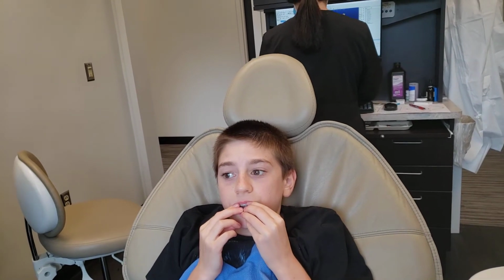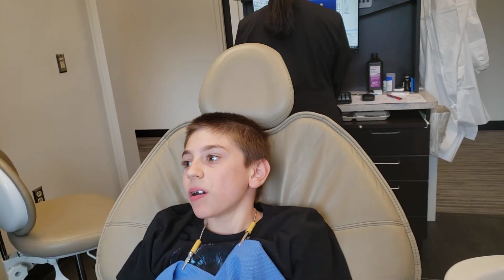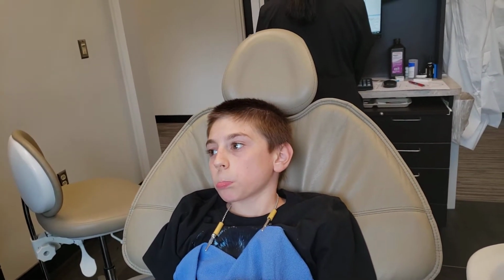Anytime that is in his mouth, his lips need to be together. You can't talk with it in. That's the hard part. And you can't take it out. And so you need to swallow. Try to keep your lips together. You got it? High five. Can you do it? 10 minutes. Lips together. Great job.